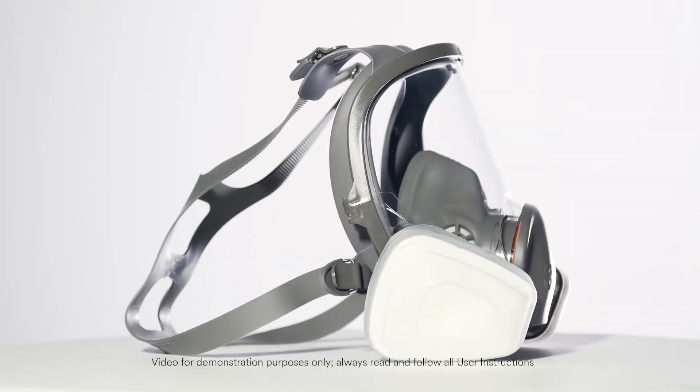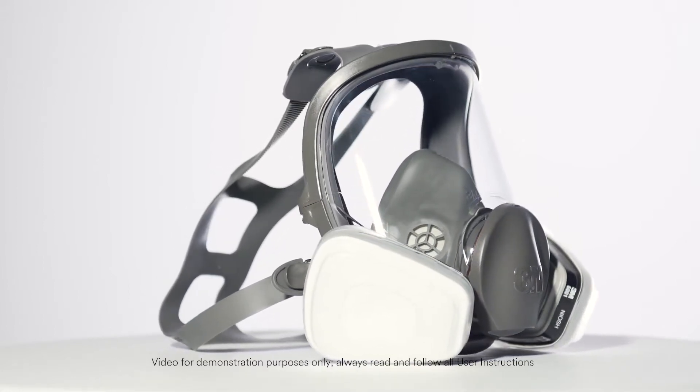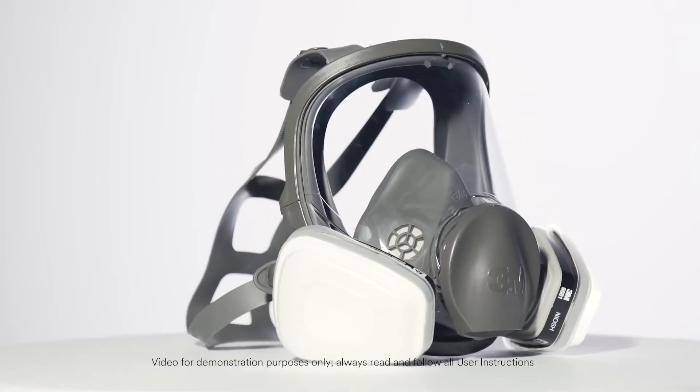Today, we will introduce you to the 3M Full Facepiece Respirator 6000 Series and provide training on how to use your 3M respirator.